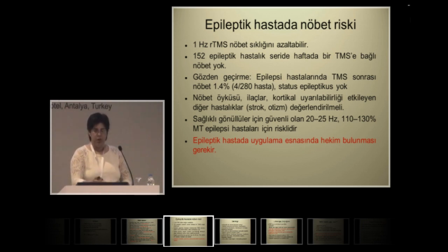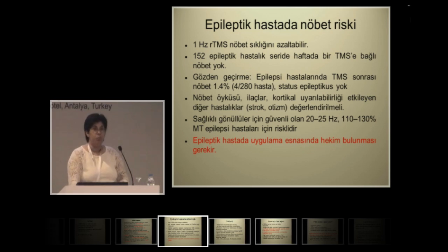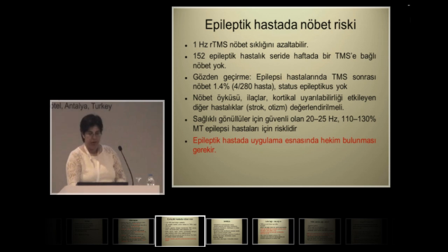And on the other side, in 152 patients, once weekly TMS was given and there were no seizures. And the rate of seizures in epilepsy patients after TMS is only 1.4%. Of course, we have to assess the history of seizures, medications, and other comorbidities that may have an impact on the cortical excitability.